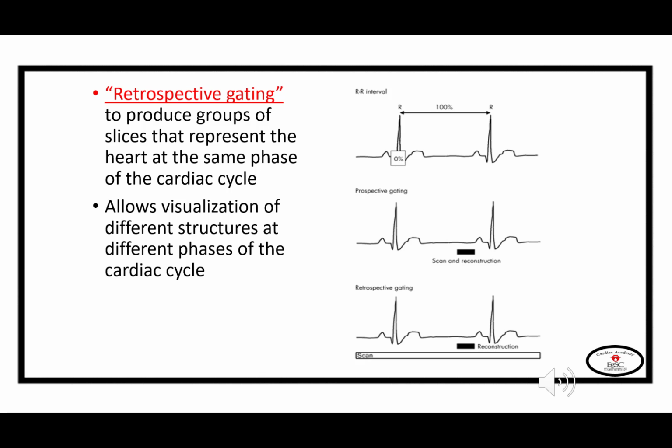This definitely provides gains in reducing the radiation exposure to the patient. However, it comes at the expense if there is some instability in the heart rate or occurrence of arrhythmia. This can produce cardiac motion artifacts that can sometimes make the whole acquisition uninterpretable.